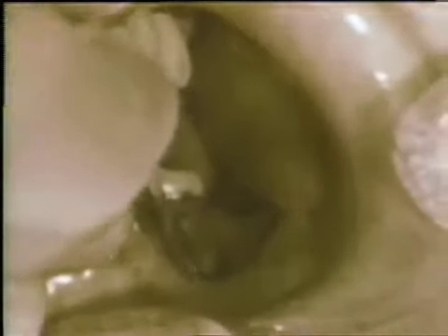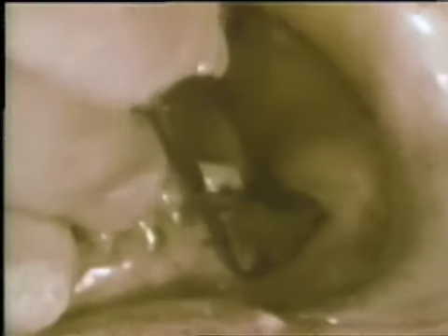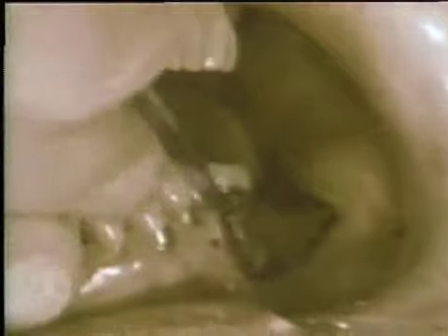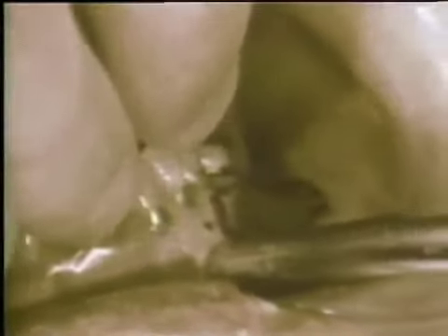The alveolar mucosa will now be removed from the recipient site. The incision is made along the penciled outline, care being taken not to disturb the narrow gingival band which will be allowed to remain. The alveolar mucosa is carefully dissected from the underlying periosteum. This type of dissection permits the retention of the periosteal bed upon which the gingival graft will be placed, thereby assuring vascularity and survival of the grafted tissue. Any unnecessary tissues left on the periosteal bed can be removed after the surface mucosa has been dissected away.